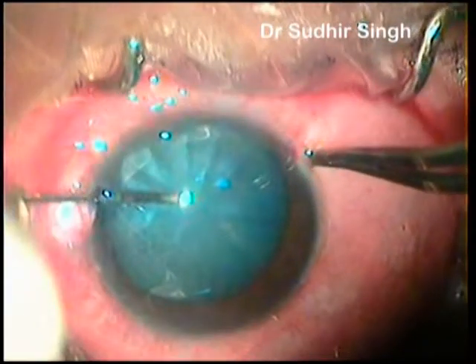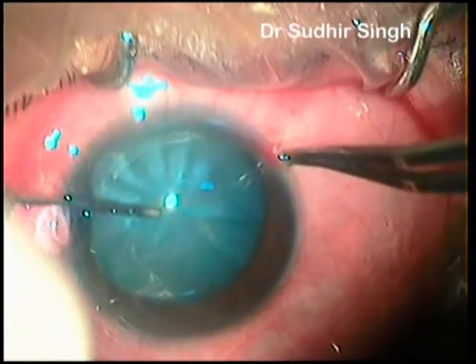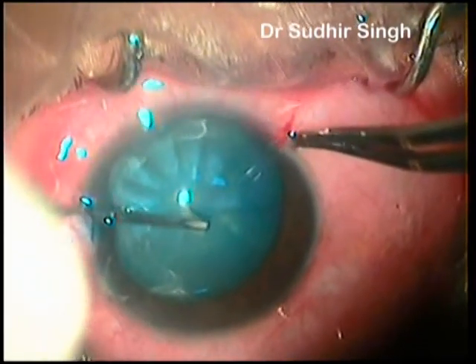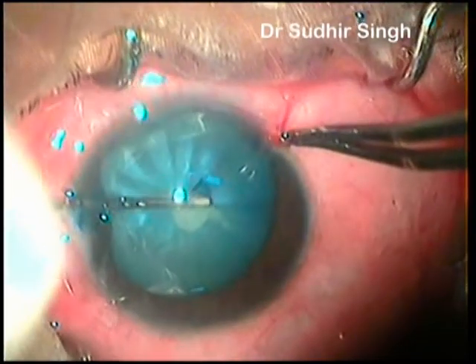The anterior capsule is stained with trypan blue dye and the anterior chamber is filled preferably with cohesive viscoelastics. We have used sodium hyaluronate 1.4% in this case.